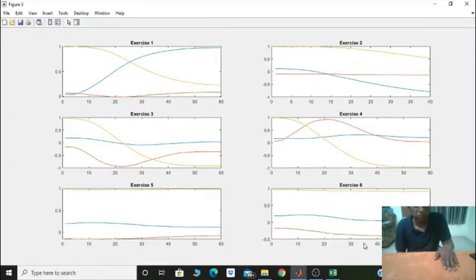These are the readings of the accelerometer. So when you carry out the exercises, you get totally different sets of readings. And based on this, you can not only distinguish between the exercises, but you can also track how the exercise is progressing. The x-axis is in duration.